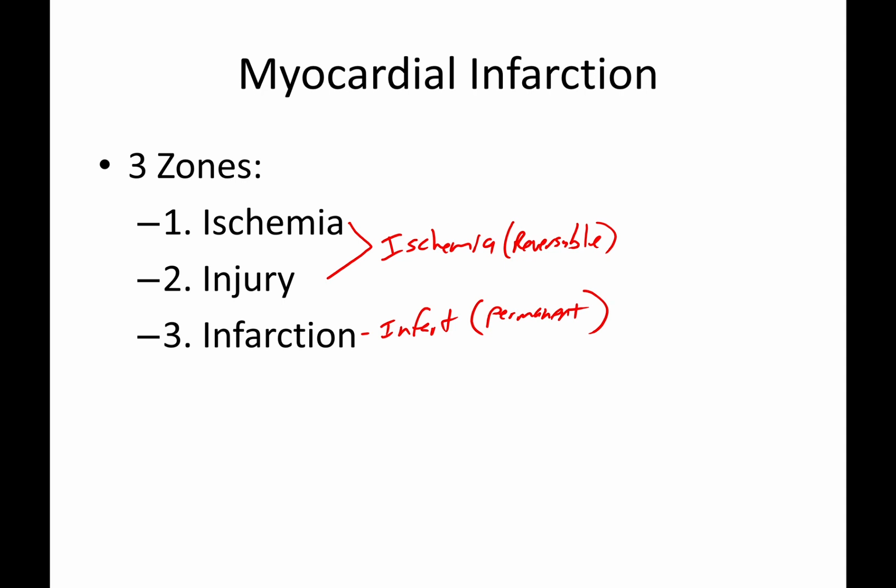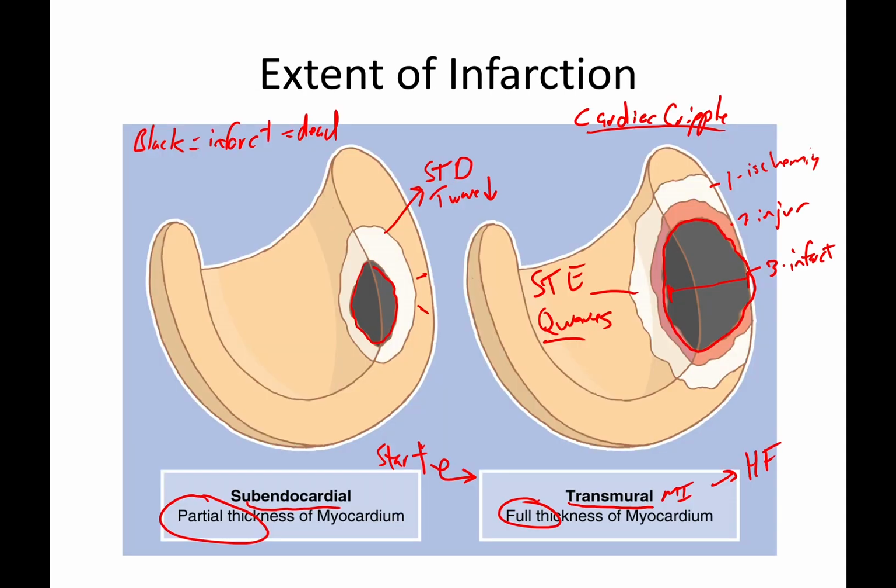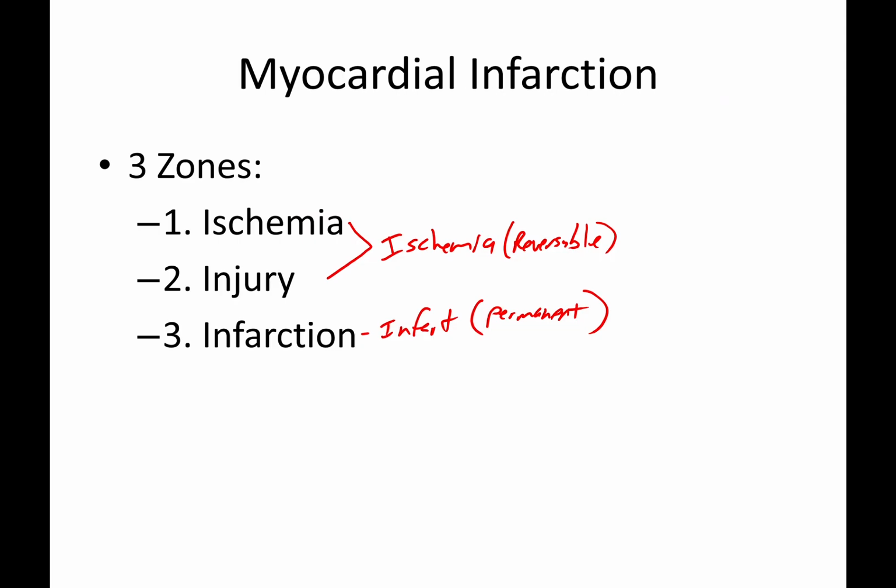All in all, it's shades of gray, and I'm going to kick back to the previous one that, even though we have these zones marked out, it's like all things. It's almost like with strokes in the penumbra. There's that zone where things are not going well, and then there's the zone where things are absolutely, truly dead. And that would be about all I have to mention on that.